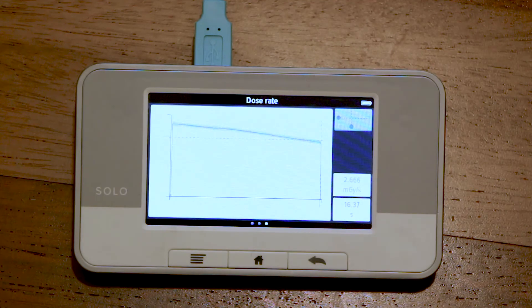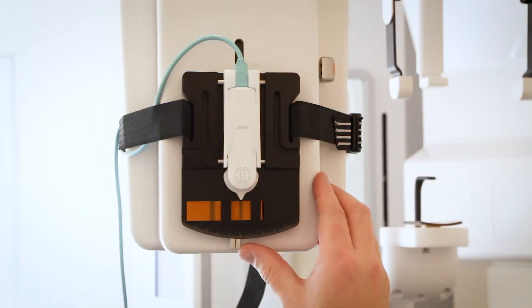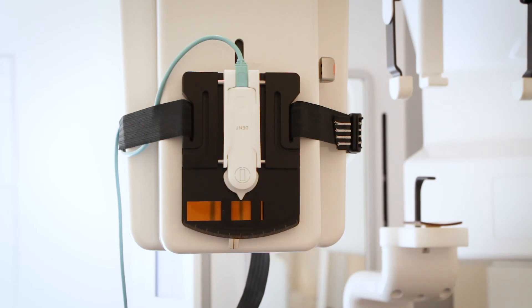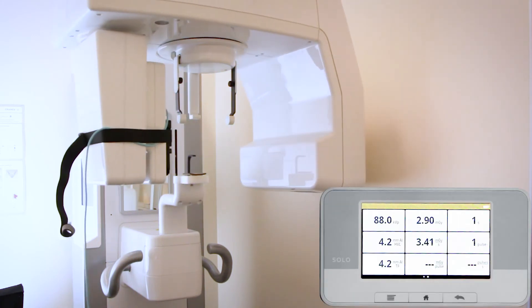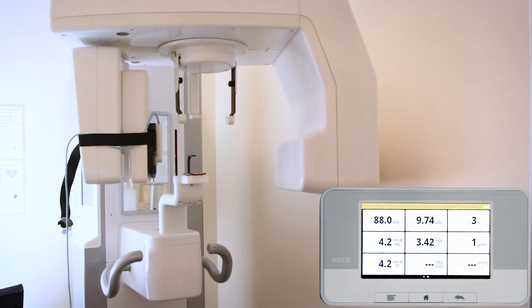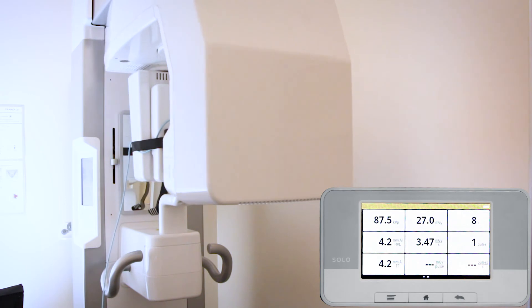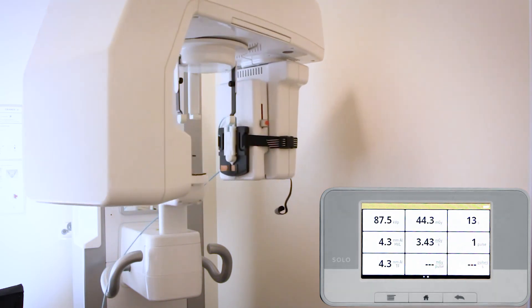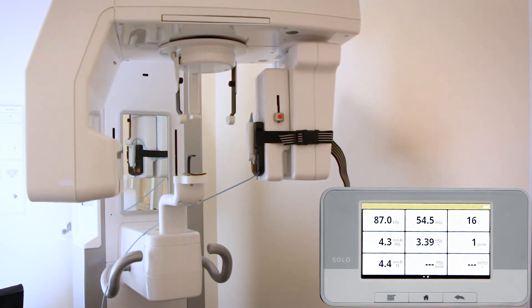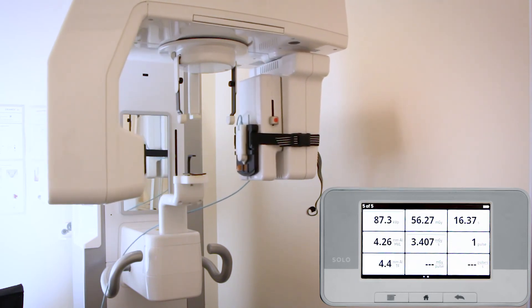On some machines the dose rate can be an indication of the position. If the dose rate waveform is leaning, the sensor is not perfectly centered in the radiation field. The center position can be as sensitive as 0.1 millimeter.